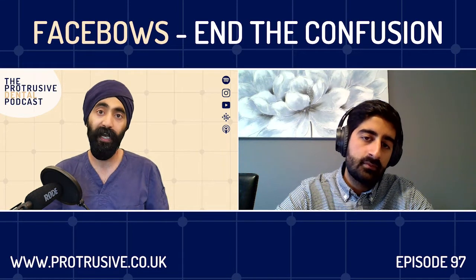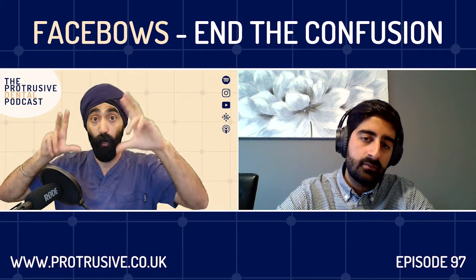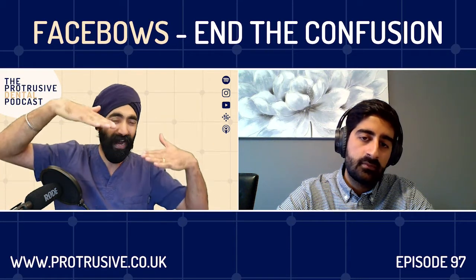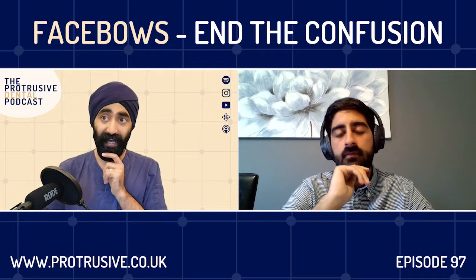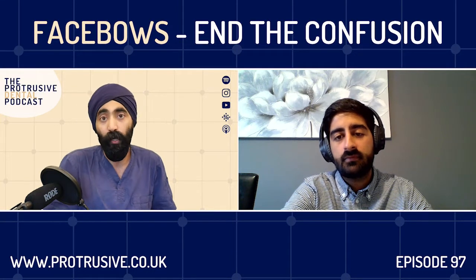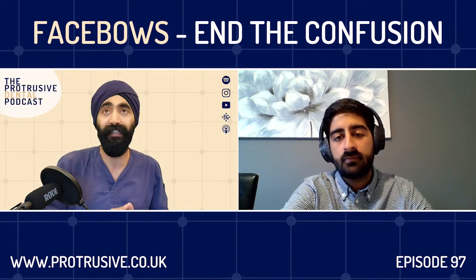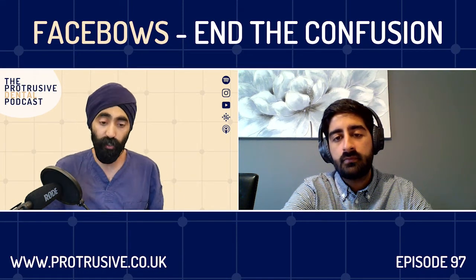And then you can even take a photo when your patient's got the Facebow on as well, just to make sure later you can look back and think, okay, did I have everything? Did I nail everything? Did I get everything all correct? And this is all there to help you make better temporaries for fewer adjustments. And then when you've got everything right in the temporaries, we can transfer it to the mouth and do the least amount of adjustment possible so you're not drilling away your precious zirconia, ceramic, your restorations.